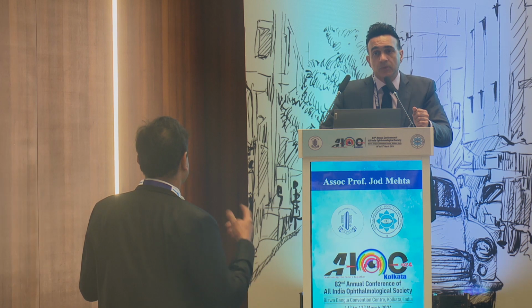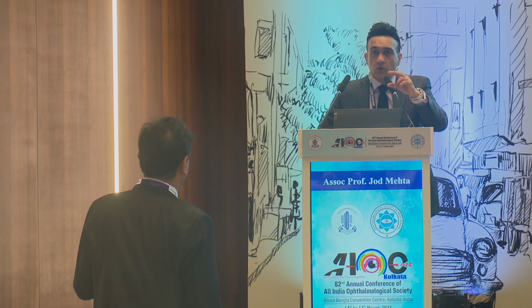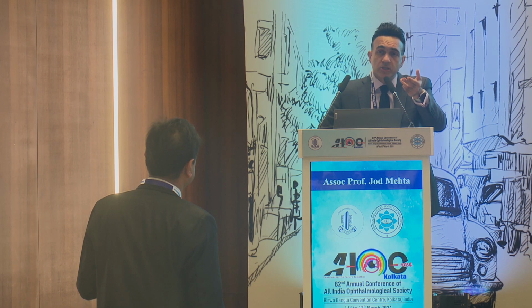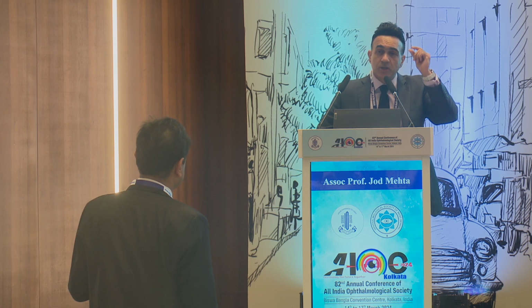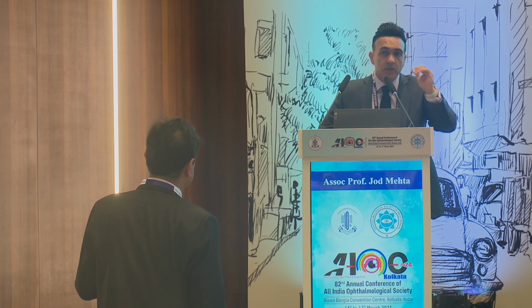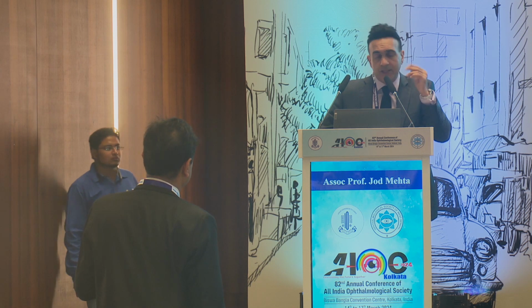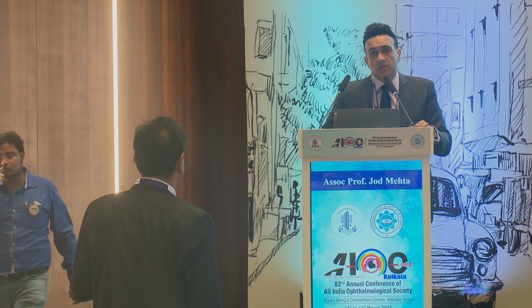Okay, so the parameters have to be taken from that. Yeah, you can take that, but your pocket was probably also about 150, right? Yeah, correct. So you can do OCT to give you some sort of idea, and the Circle software allows you to have a 10 micron side above and below. So I'd aim for 150, and you're going to get very close to the level of the interface. So I'd make it into a flap, and then start with the haze treatment from there. Thank you.